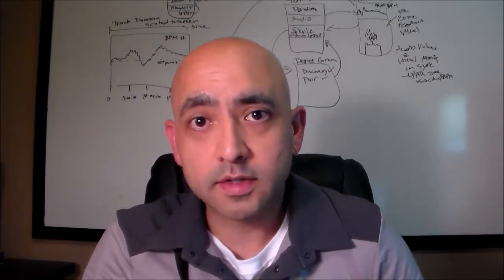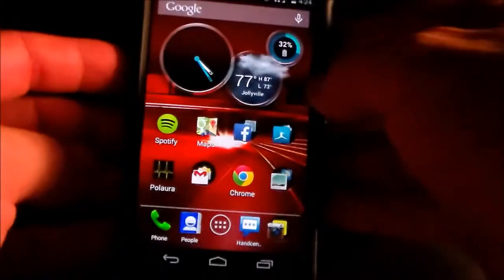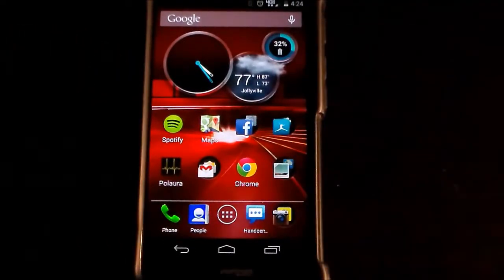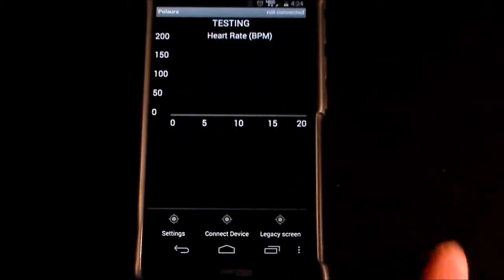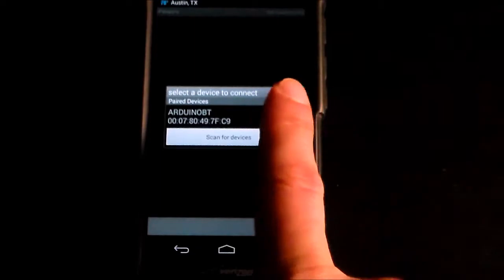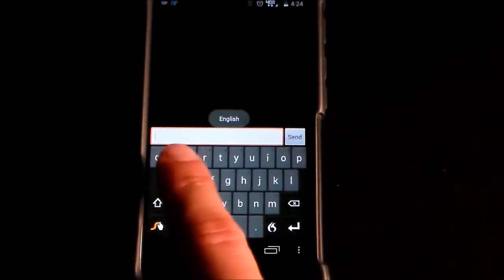And so now we're going to take a look at how the app works on the cell phone.